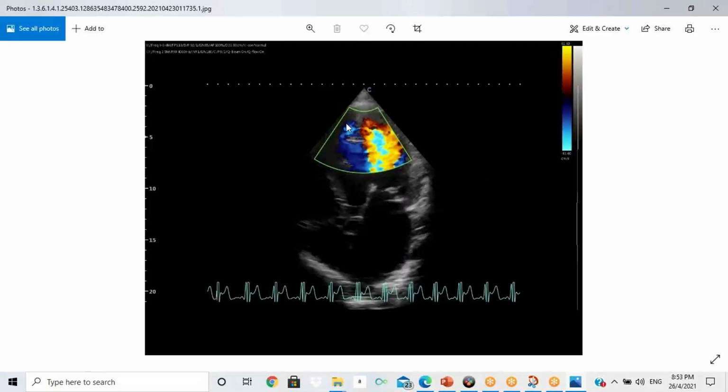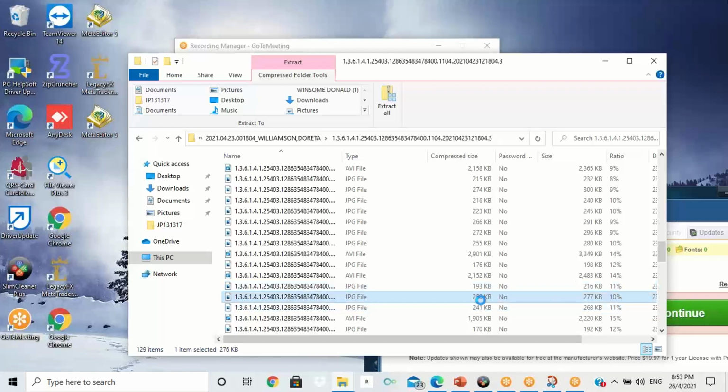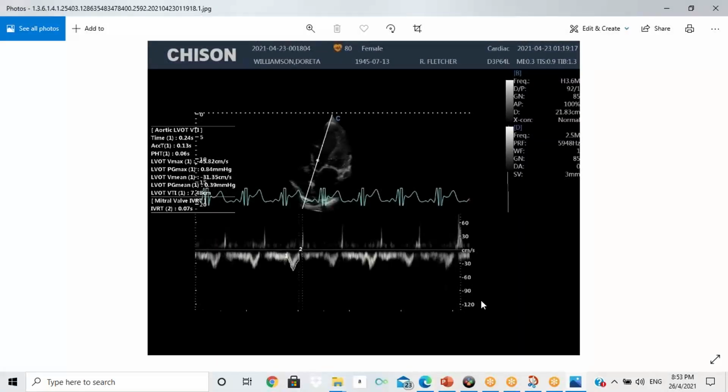Okay. So the color pretty much fills everything, so I don't think there are any clots there. But we have contrast that we can put inside the LV cavity, and if it fills the whole cavity, then there's no blood clot, there's no space occupying lesion. If it fills a portion and leaves a portion unfilled, then there may be a clot.